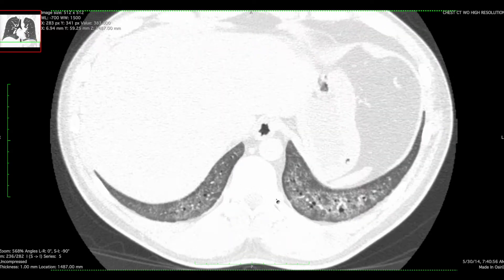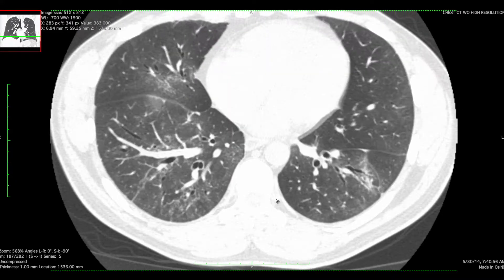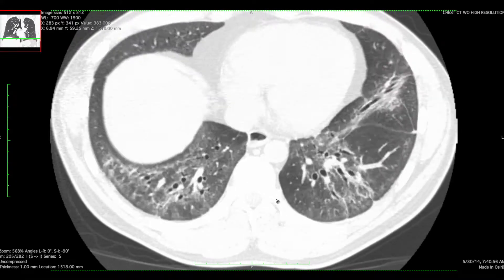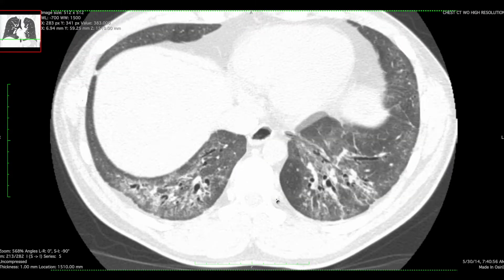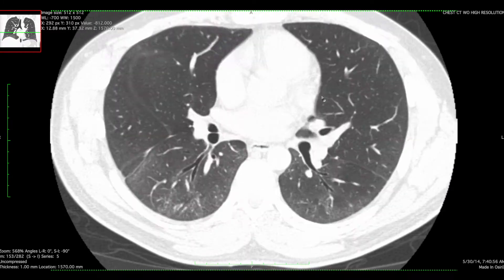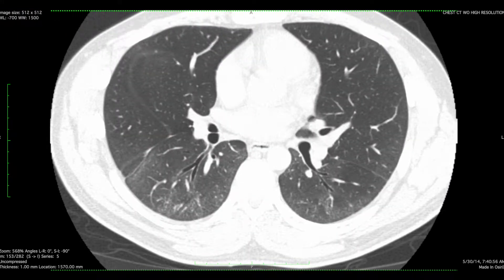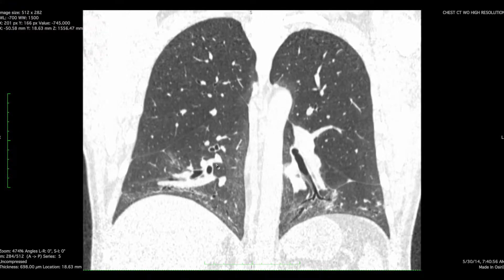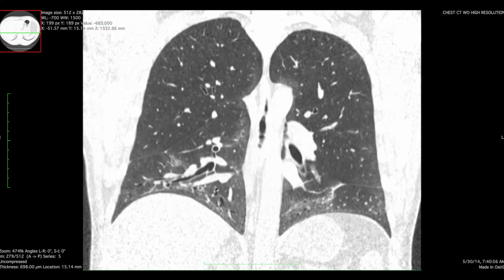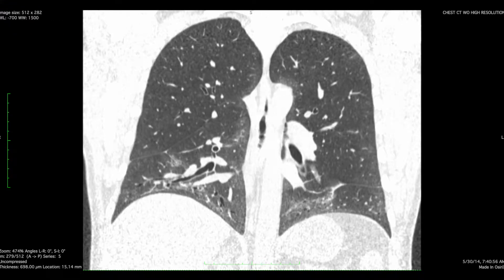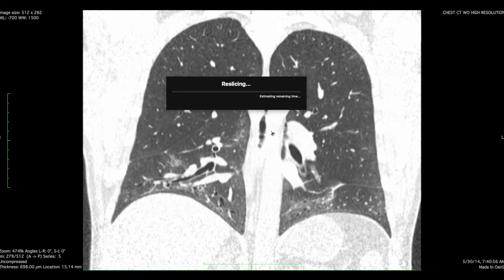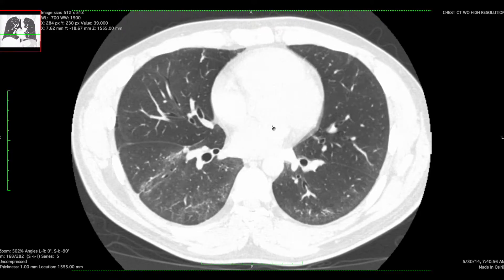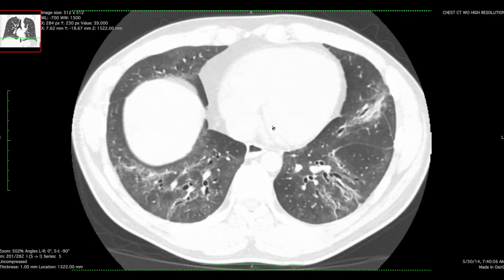The zonal distribution looks like it's sparing the upper aspect of the lungs. To me, this looks pretty convincing for basal predominance. We could reformat the coronal plane to show that indeed it is basal predominant. In the axial plane, it should be pretty striking — there is subpleural sparing.